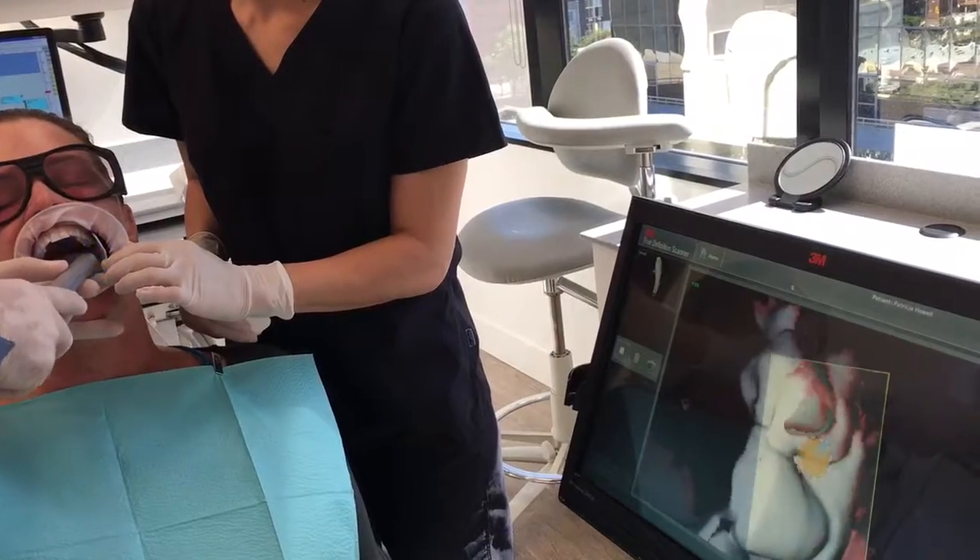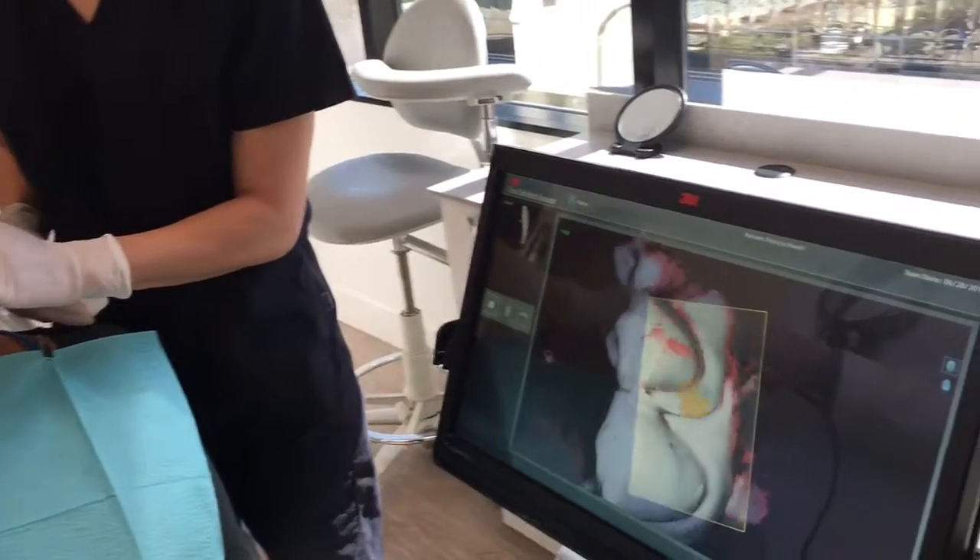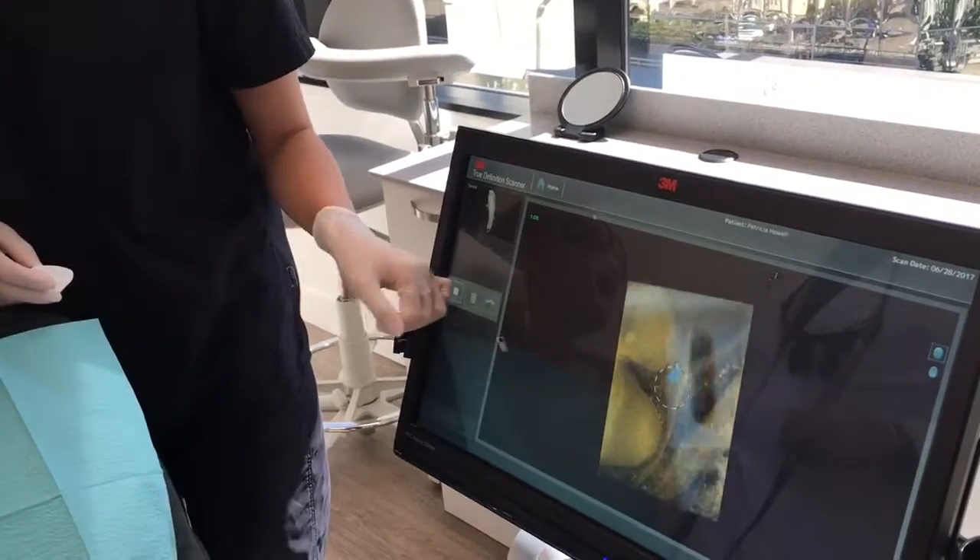Every once in a while you'll get that little double image, but you just rotate the buccal to lingual and you can stop that, and then the scanner will correct itself.